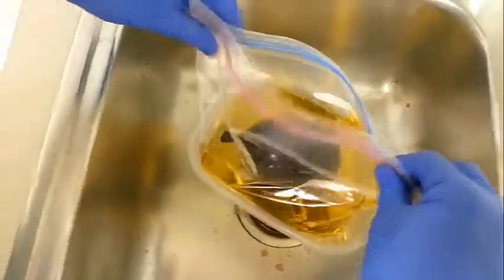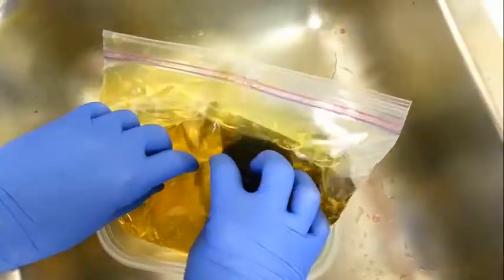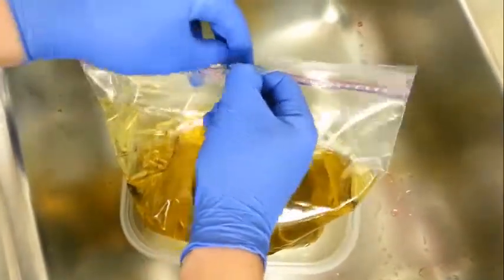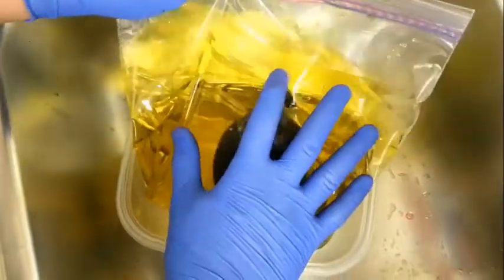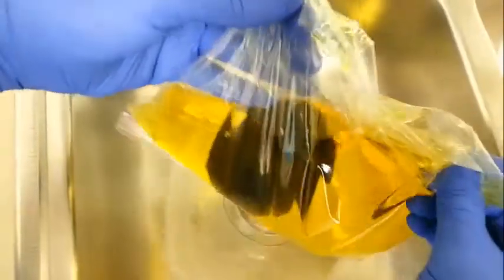Typically get the bag mostly closed, leaving just enough for air to escape. Try to get as much of the air out of the baggie as possible, then re-seal. Do this a couple of times to get all the air out. Make sure the heart is in the bag and it's sealed, then turn the whole thing over to get the ziplock out of the way of where you'll be ultrasounding.